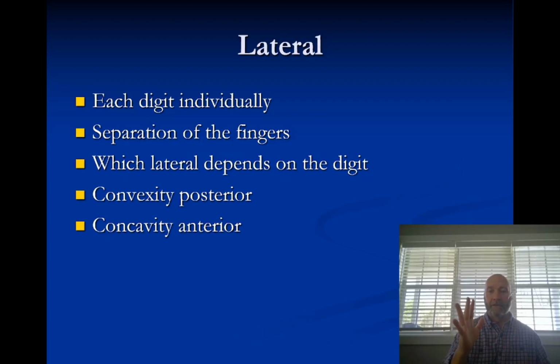And I asked her to show me how to do a lateral of the fourth digit. And if you look in a positioning book, especially in Merrill's, I don't know what Bontrager shows, but in Merrill's it shows, you can't really, that's as far as I could straighten my ring finger. So to get it any straighter than that, I have to push it like that, which is going to be very painful for the patient with a broken finger. Now, the likelihood the patient has a broken ring finger, and that's the only finger that's broken, is, in my experience anyway, pretty rare, but it could happen.